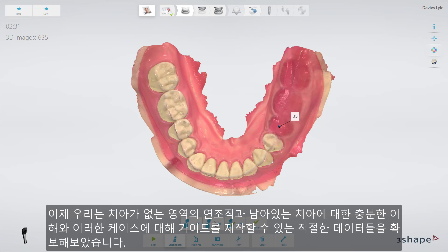We now have the proper height to use for our design of the guide, as well as a good understanding of the remaining teeth and soft tissue in the toothless area.